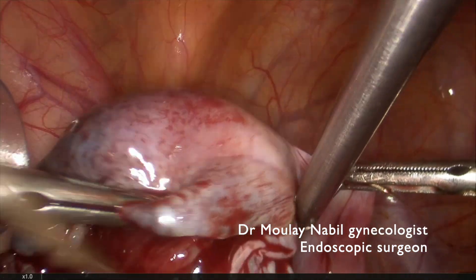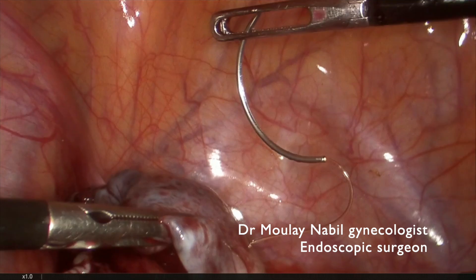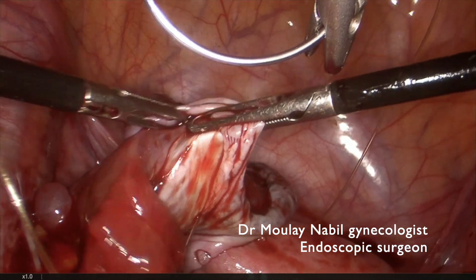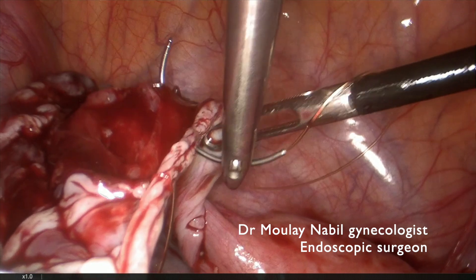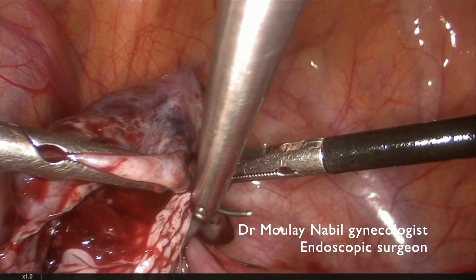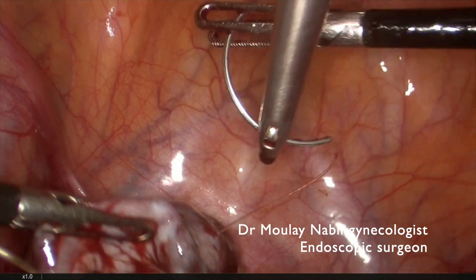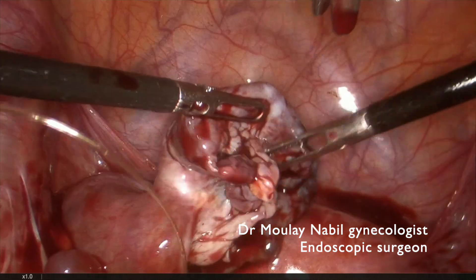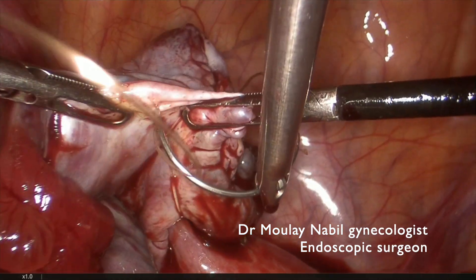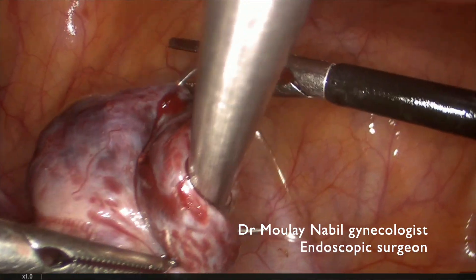In this case, we need to do stitches for hemostasis. The suture that must be used in these cases is a monofilament suture. We just reconstruct the normal anatomy and do not tie the knot too tightly. There is a previous ischemia resulting from the torsion, so just anatomical reconstruction is needed — we place the knot and do not over-tie it.